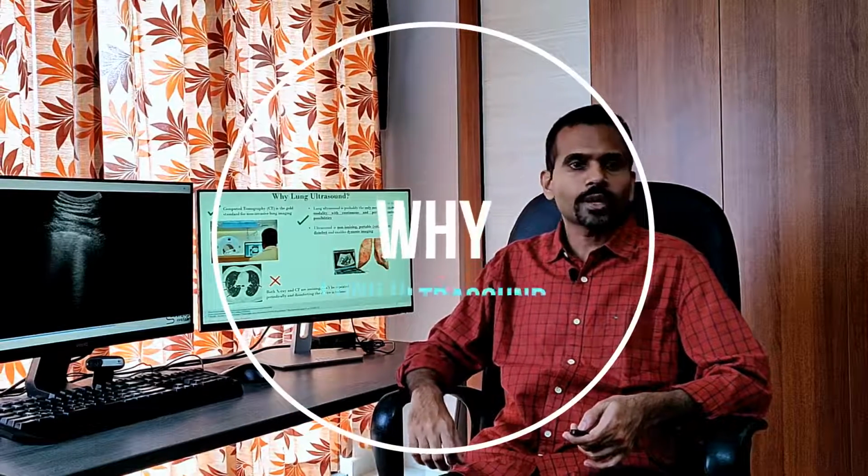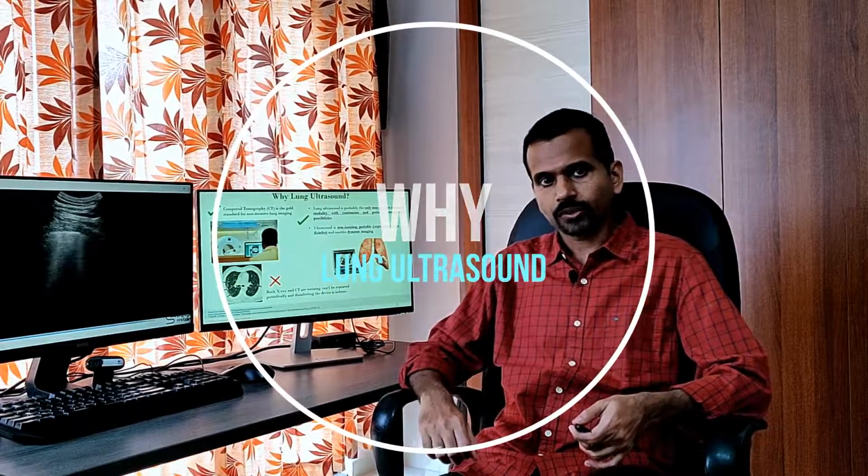Hello everyone, I would like to introduce an interesting project that we are doing at IIT Palakkad on an automated lung ultrasound video analysis tool. This project has been developed as part of the COVID-19 initiative from IIT Palakkad. The first question that I would like to answer is: why lung ultrasound?